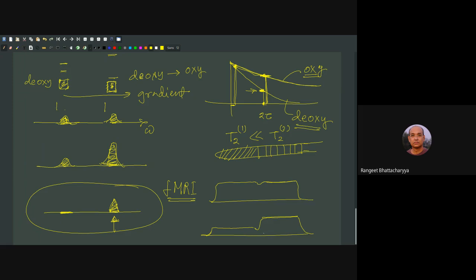If I can take a difference of the two spectrum, of course, after I scale it to this level, then only the remaining portion will show up as the active region. In our case, there was no activity going on. It was like permanently we replaced the deoxygenated blood by oxygenated blood, and this is why we could see that. But this is just a demo. We oftentimes record such spectrum. So what I show you is basically the simplest possible way of finding out some region which is active.